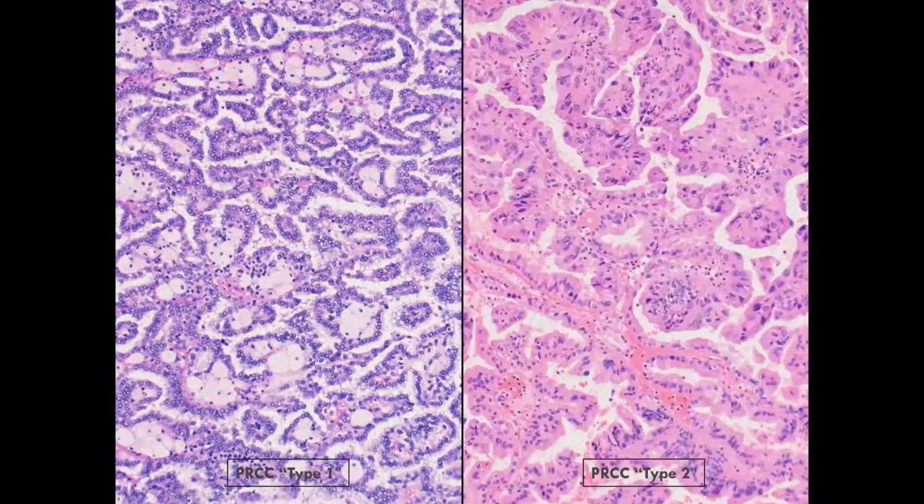And on the other hand, you have this papillary carcinoma, which is very eosinophilic, with abundant cytoplasm. You have high-grade nuclei that are in many places pseudostratified, and you don't have any macrophages in the core. So this would be the classic appearance of type 2 carcinoma. Unfortunately, it's very rare to see this kind of pure appearance in papillary carcinoma. You might see this often though.